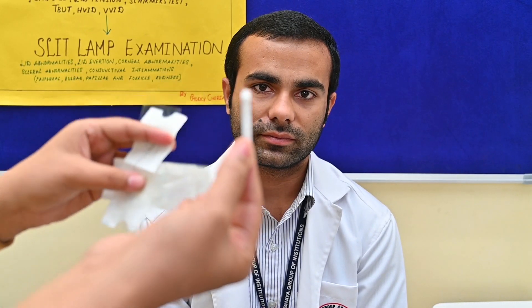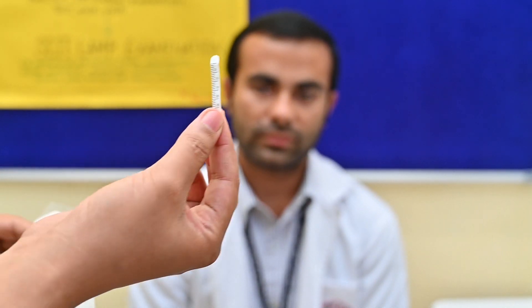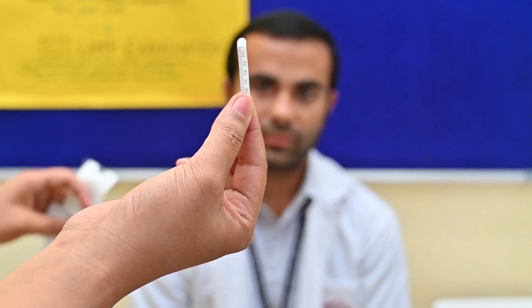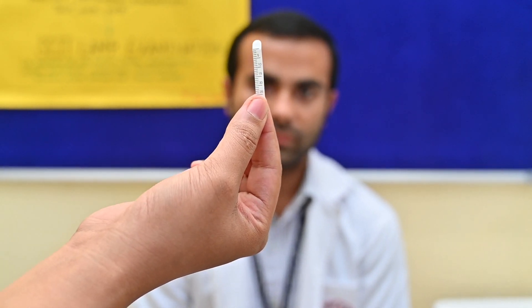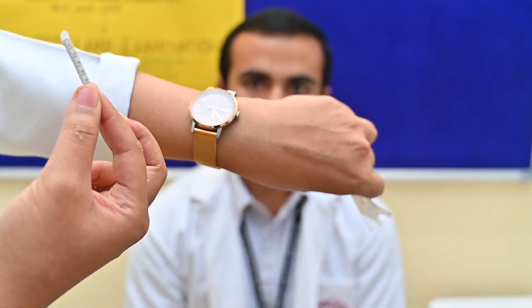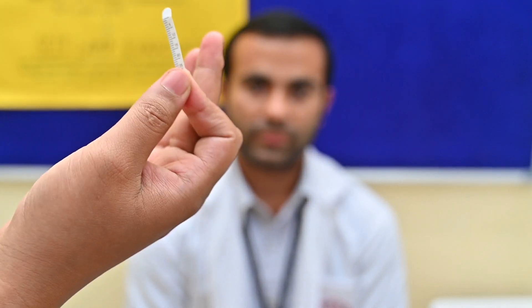You can place this for 3 minutes or 5 minutes. As per recent studies, the 5 and 3 minute test is considered the same. You have to place this in the lower fornix, 2 thirds from the medial canthus and 1 third from the lateral. Fix the time — 5 minutes or 3 minute duration.